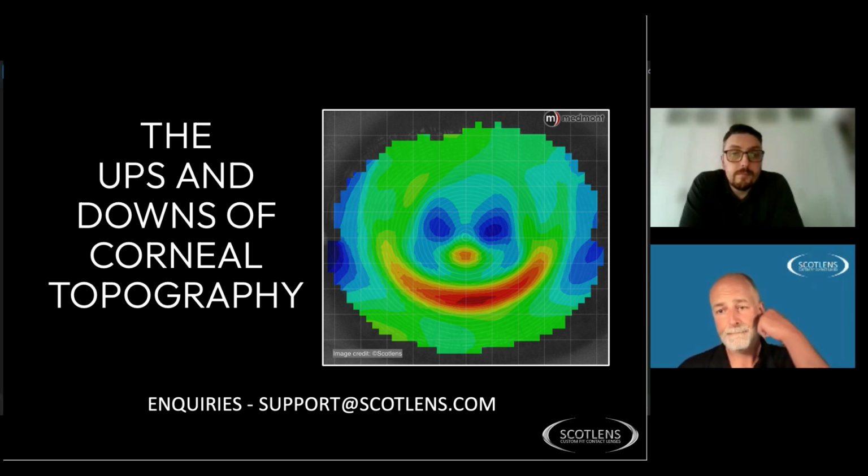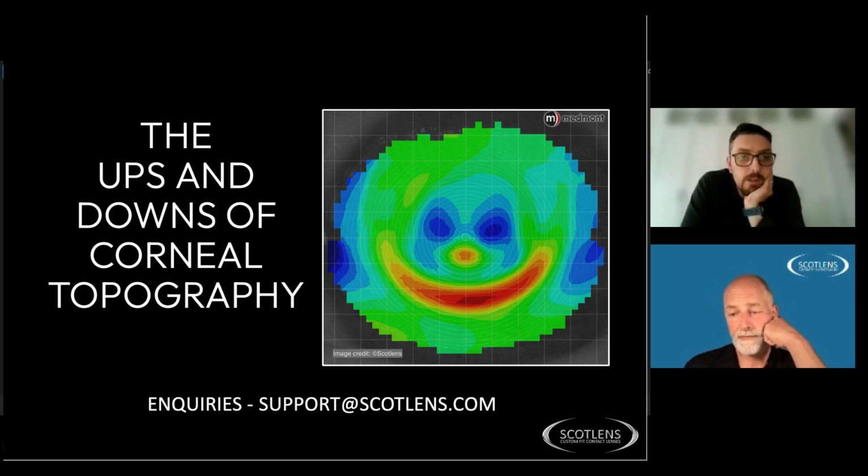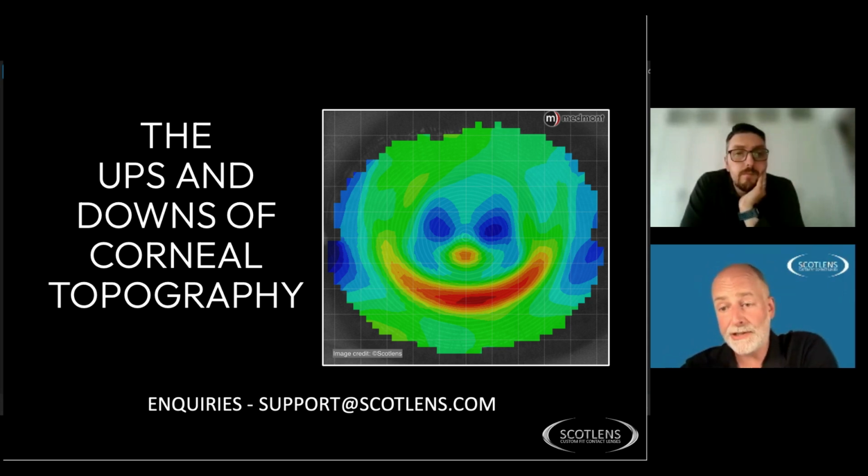But yes, we used to use Pentacam when I used to work in laser surgery, so it was the kind of go-to back then. So the Pentacam is great from a surgical perspective, and it shows you the back surface.